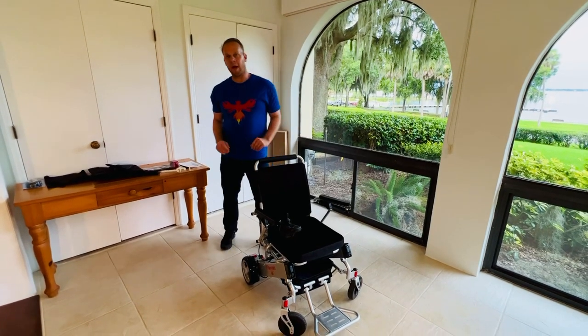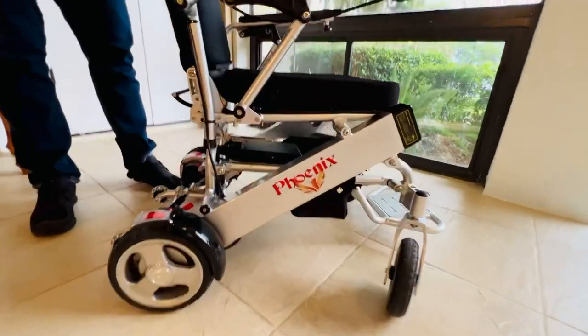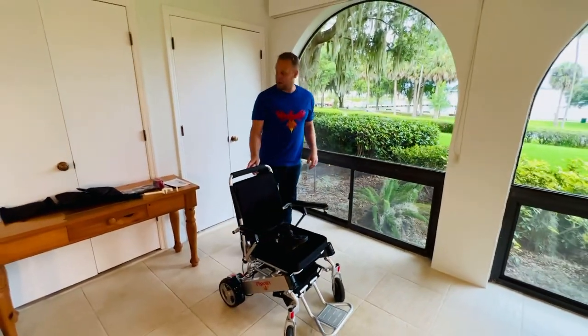Hello, this is Paul from QuickenMobile.com and we are here with the Phoenix Power Folding Wheelchair in our video operating manual series. We are going to be demonstrating taking the batteries out of the chair in this video.